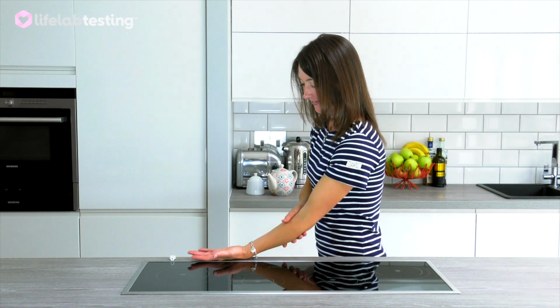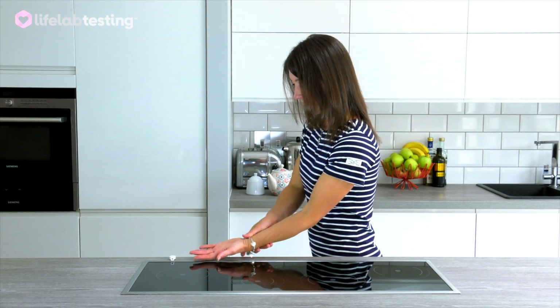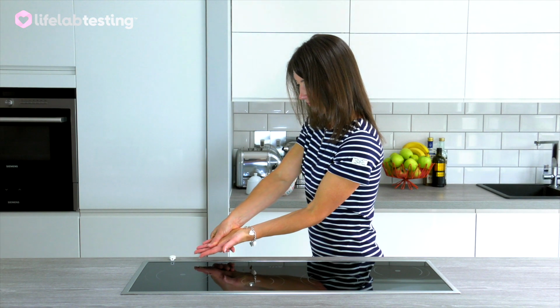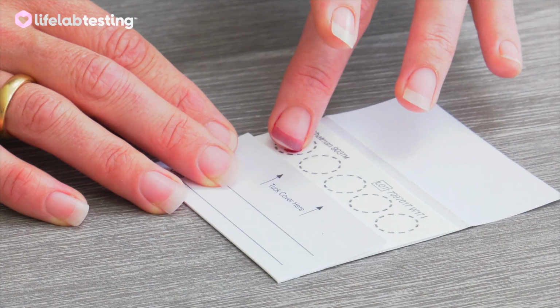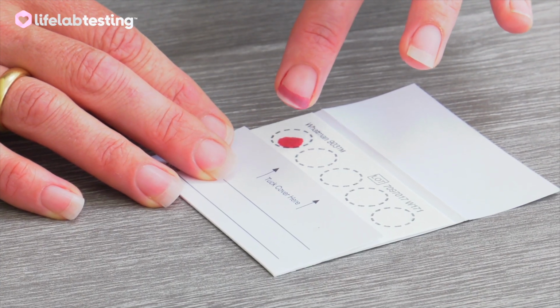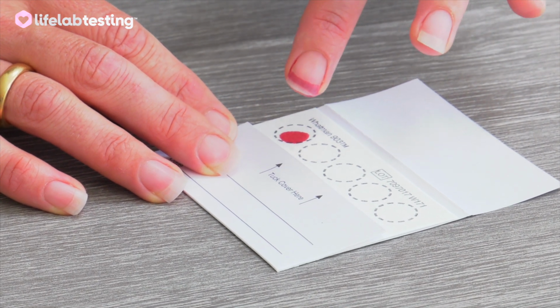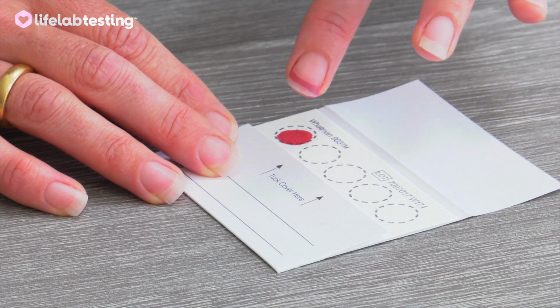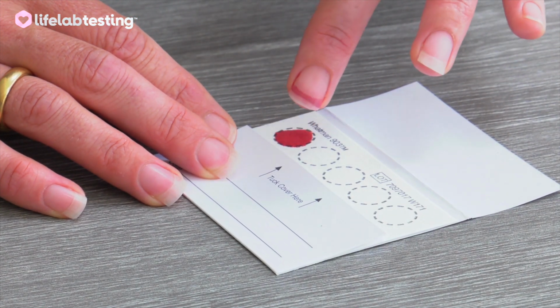Keep your hand horizontal at hip height while standing at the edge of the table. Massage your finger from the palm of the hand to the fingertip until the blood droplets fall. Hold the base of the collection card to prevent it from moving. Allow blood to drip onto each of the circles, filling each one carefully. Make sure you do not touch the collection paper.